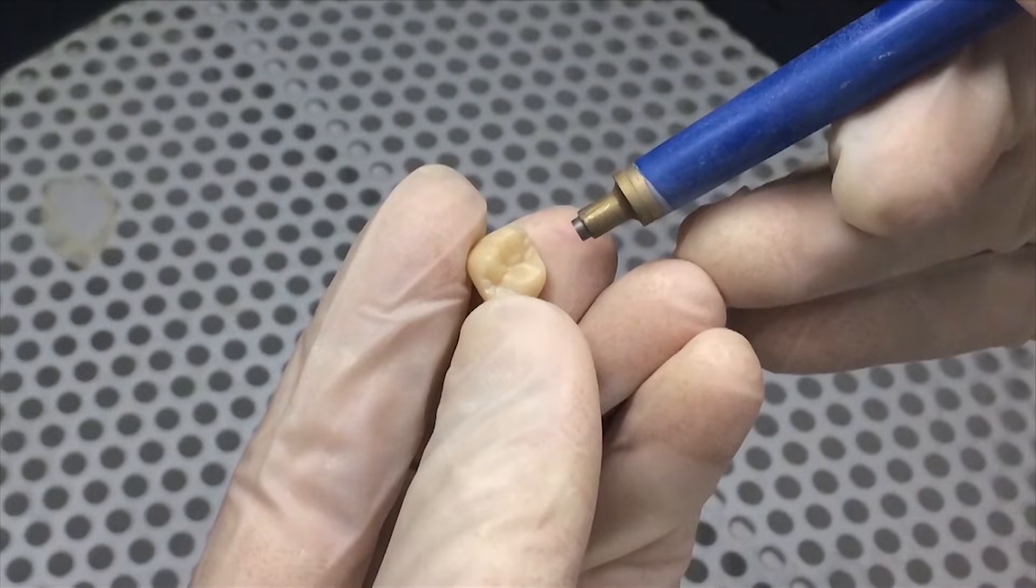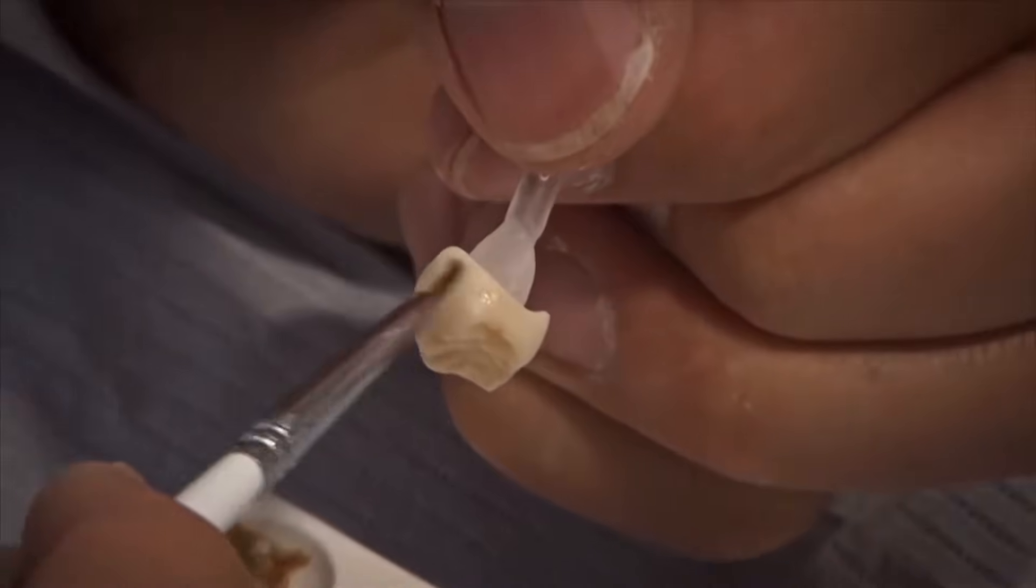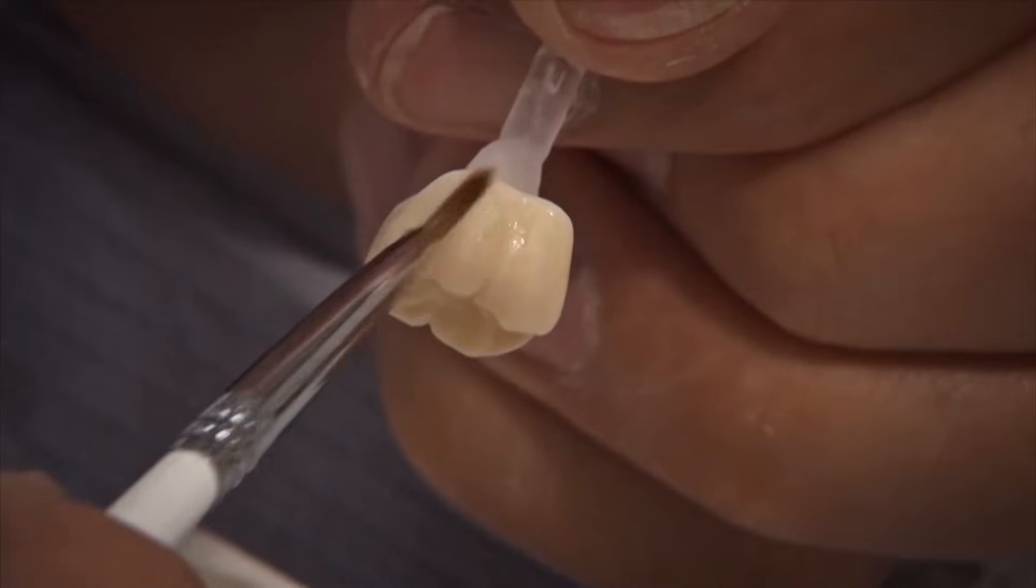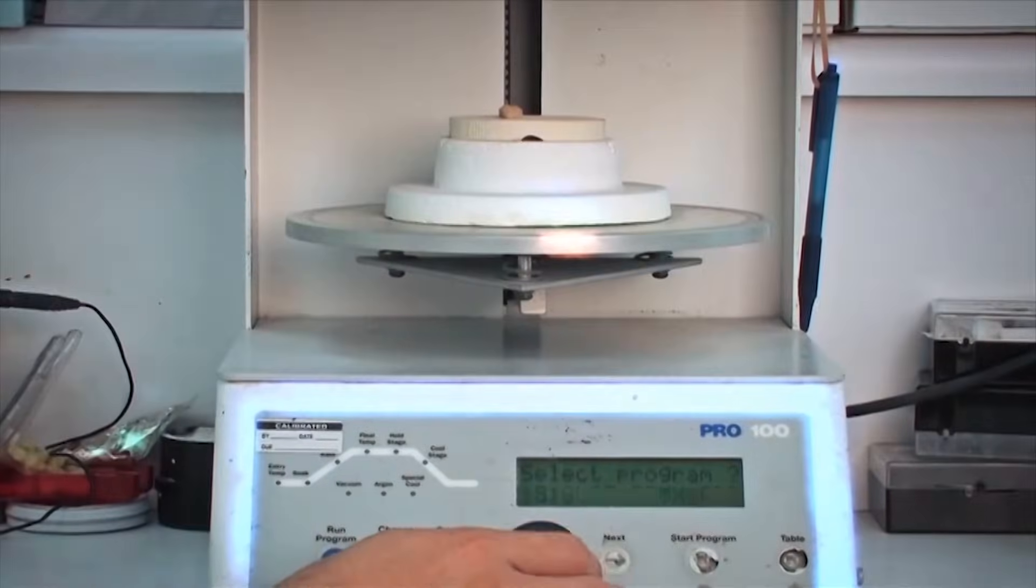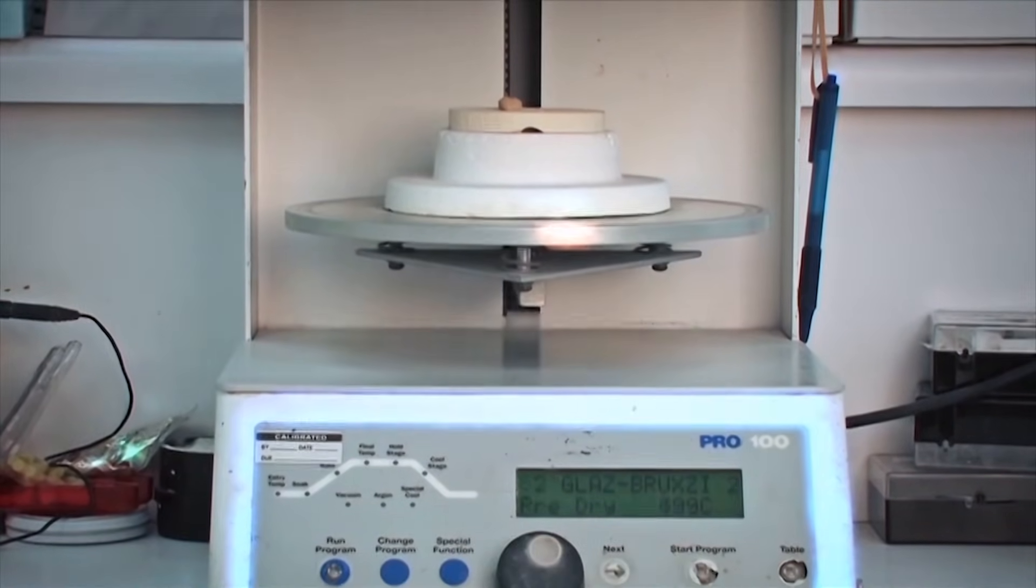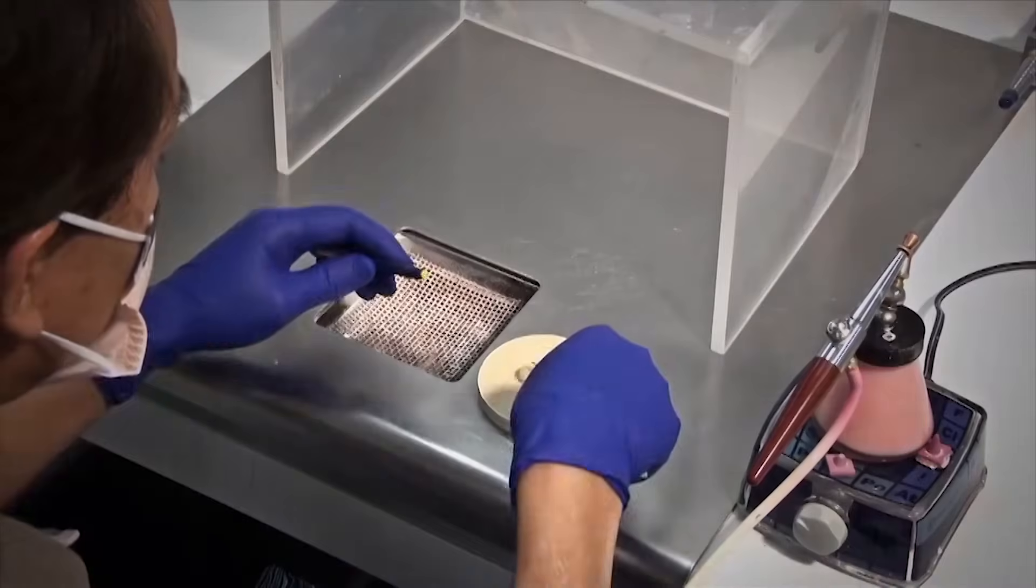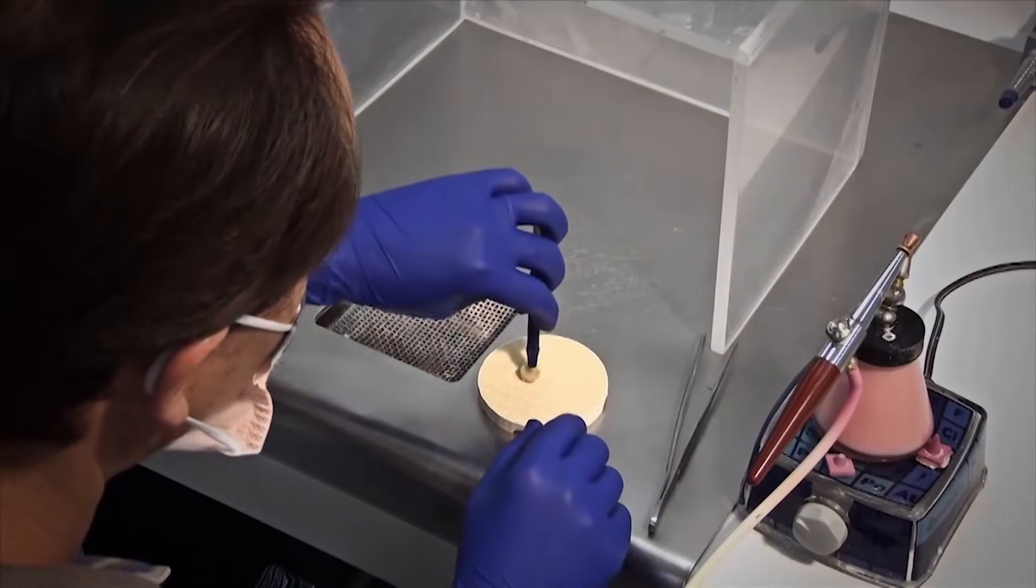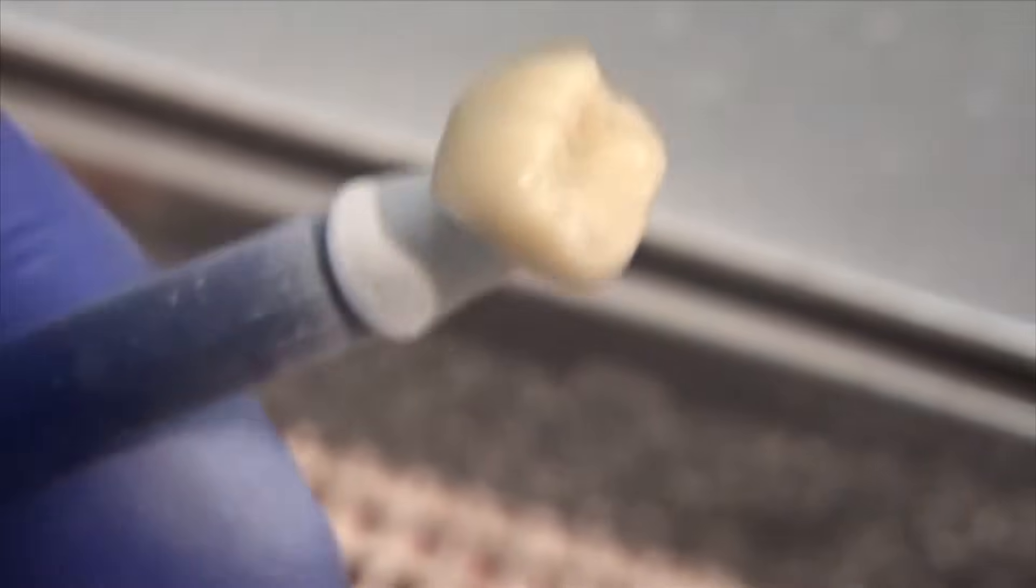Once it comes out, we do a little sandblasting to get it all cleaned up. And now we're going to put some color on it. So this is some staining that's being done to match whatever color the dentist has requested. The block started off as an A2, but there's still a degree of characterization that needs to be done. Typically, we're going to have some translucency by the cusp tips, and we're going to have some increased chroma in the gingival third.